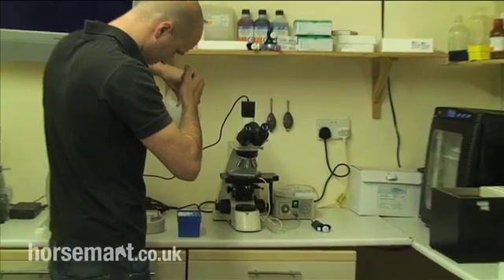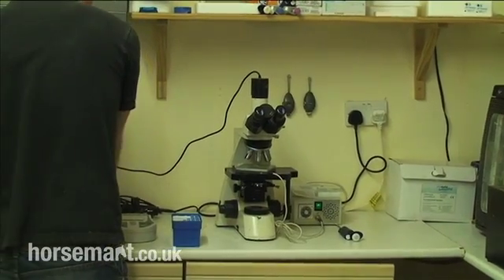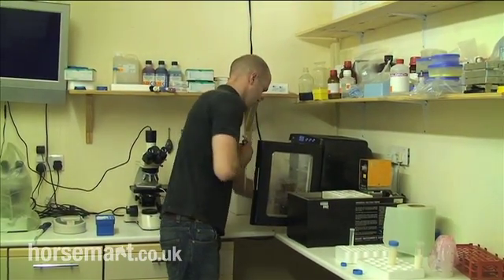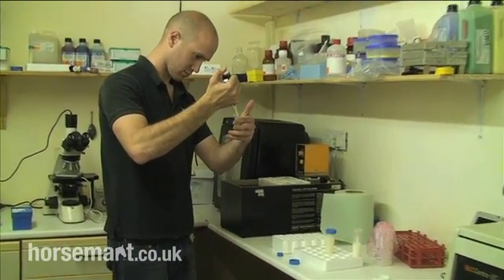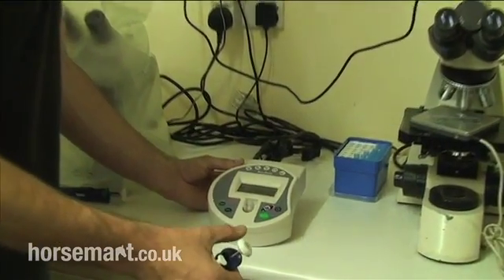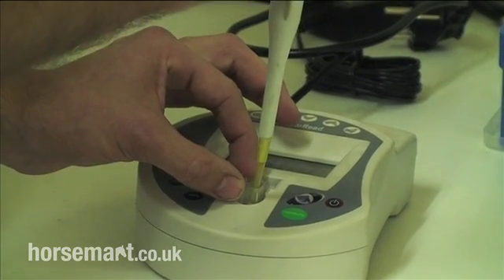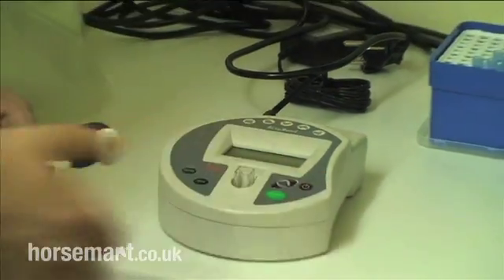Jamie's now taking a small sample of formalin, and he'll take an even smaller sample of the raw semen to do a sperm count. The formalin kills the sperm, stops them moving around, and allows the mechanical sperm counter to give a more accurate count. Jamie's got the IMV AccuRead sperm counter — this is a photometric counting device. It relies on shooting a beam of light through the sample, and the more concentrated the sample, the less light gets through to the other side, allowing you to determine an estimate of the concentration.